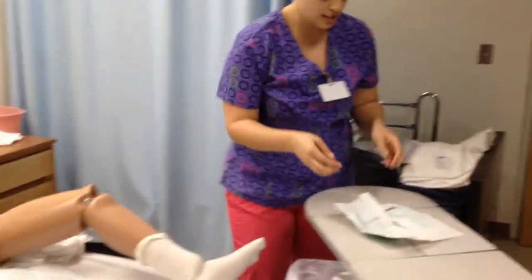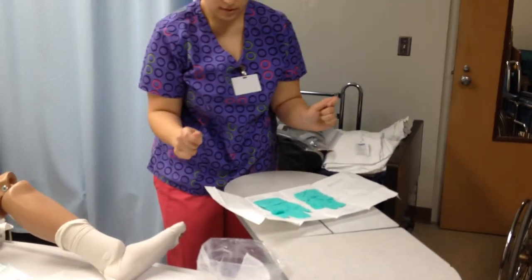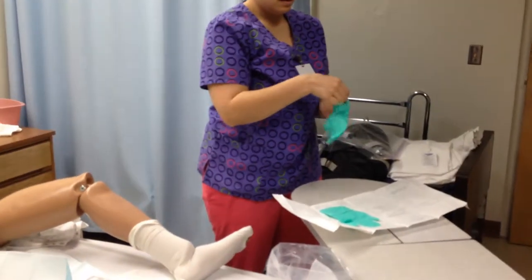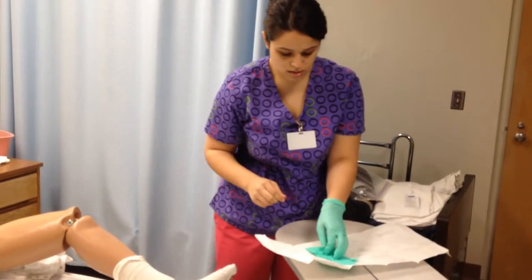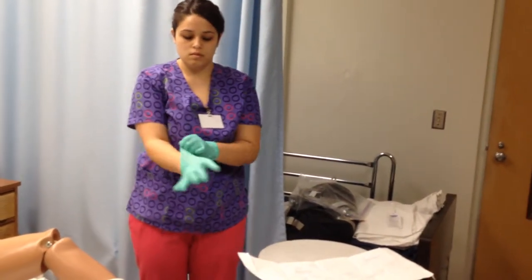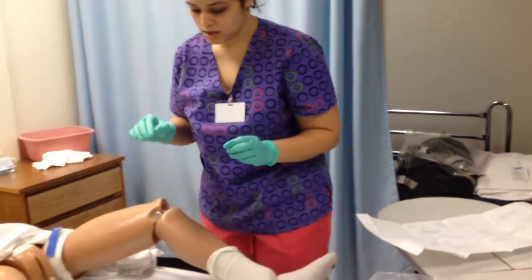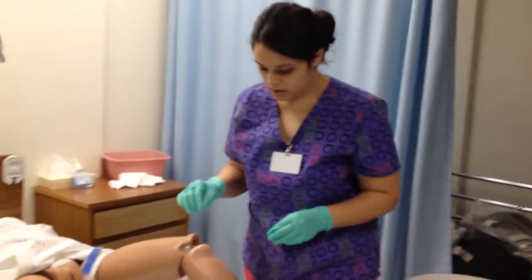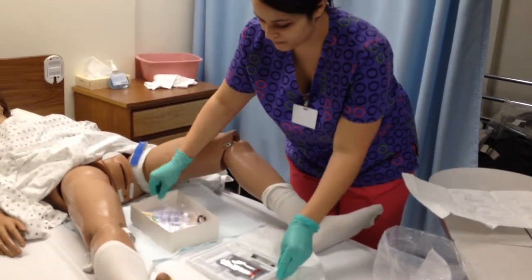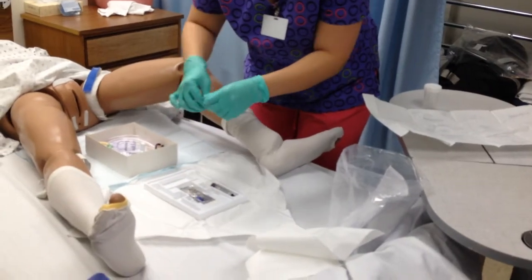Now I'm going to put my sterile gloves on. This is the other drape, but I don't need this. So now I'm going to fix the drape here. I'm going to separate this. Don't need this till later. I'm gonna open my betadine swabs.